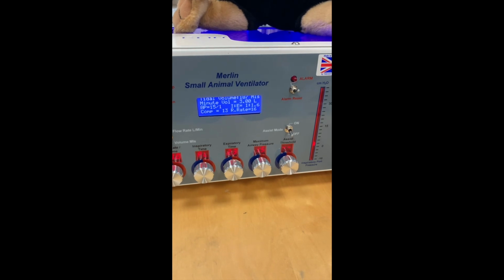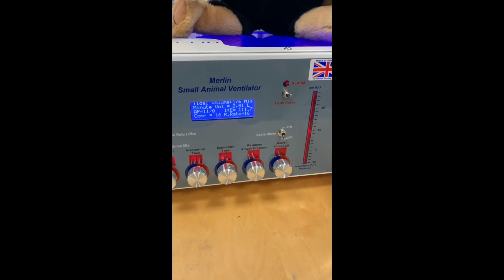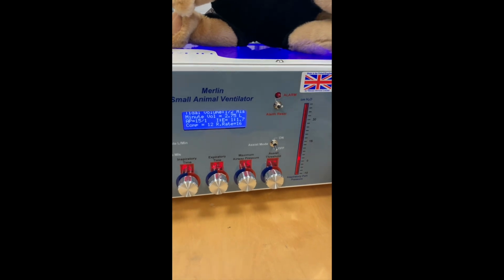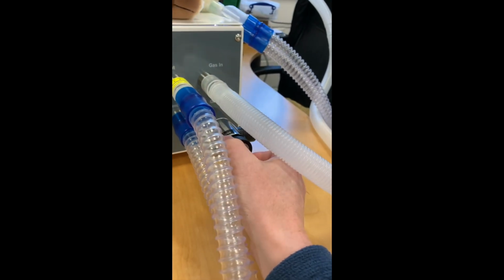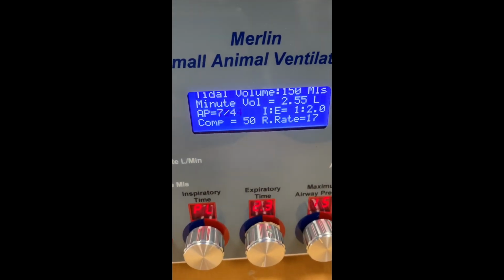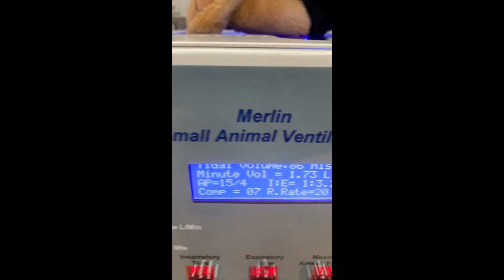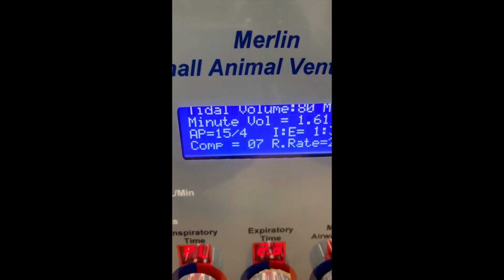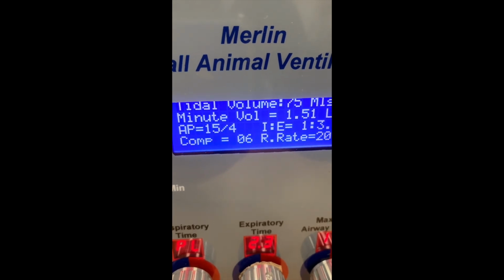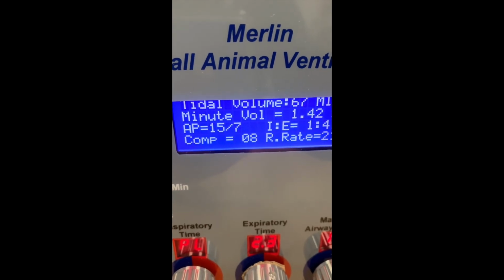Okay, fairly modest ventilation, target pressure of 15, and we see we have just 1 centimetre of PEEP there from the PEEP valve. Now I'm going to very slowly wind in the PEEP control. And you should see PEEP developing on the screen as shown by the bar graph here as well, and the absolute value is shown as a number on the screen. As I increase the PEEP, this value will continue to rise.